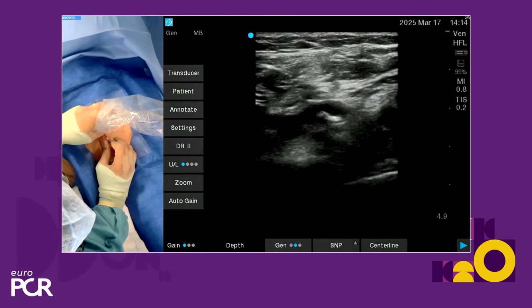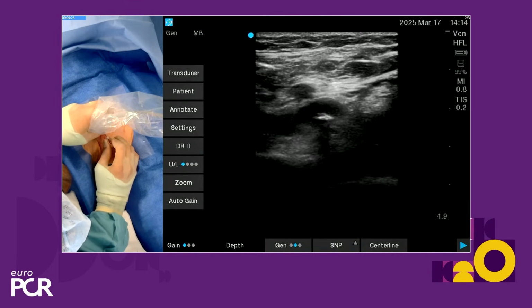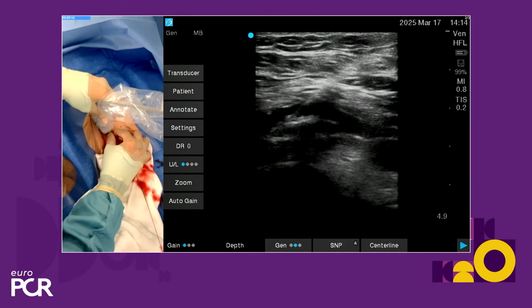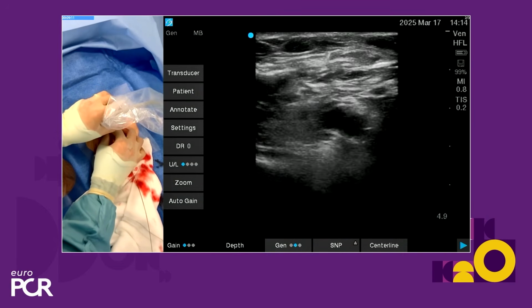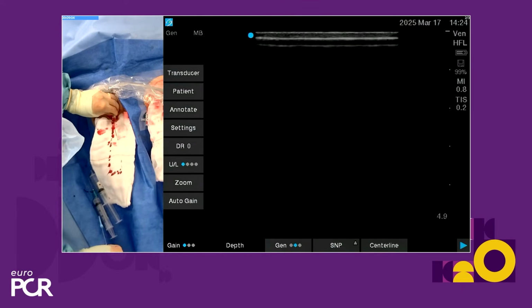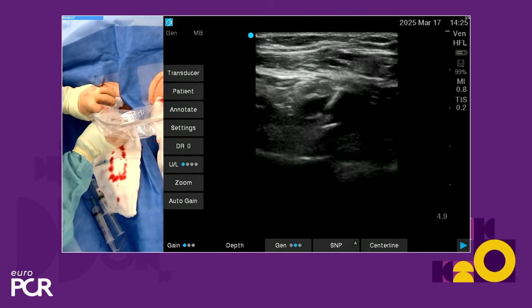And as with all of our cases, we start with ultrasound guided access. Now, this is a bifemoral case because this lady has poor radial access. There we are in short axis view using a 12 o'clock puncture, and you can see as we swing into the long axis that we've got excellent placement over the centre of the femoral head, and there again in the short axis we see we're entering at 12 o'clock. So the team is satisfied that we've got adequate access there.